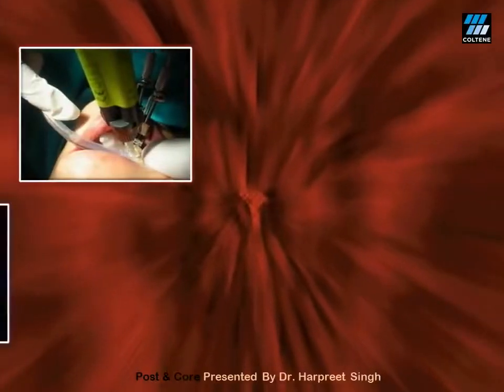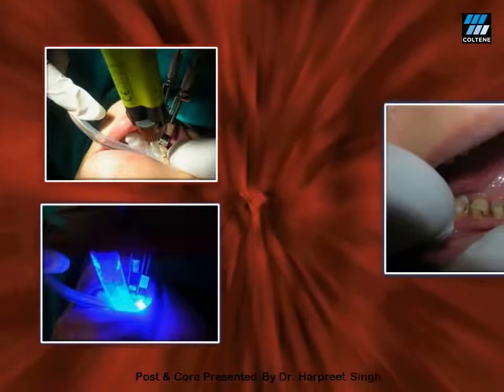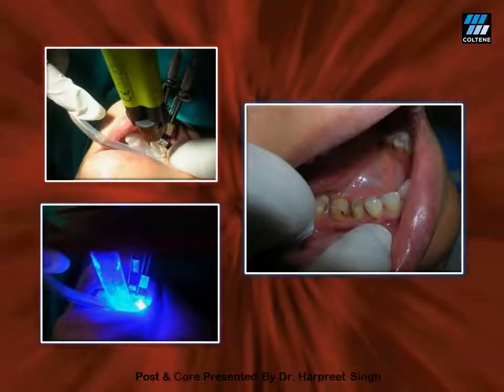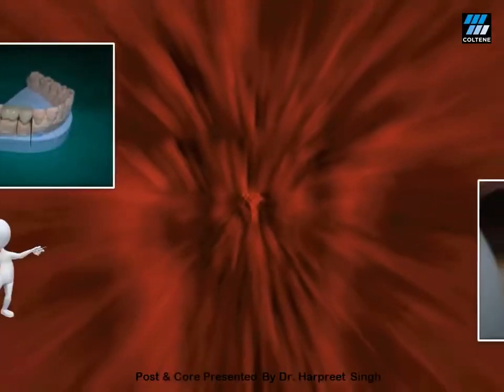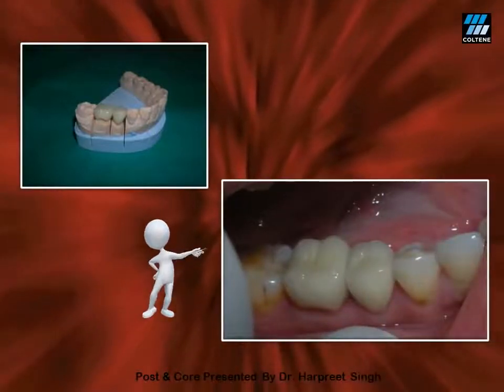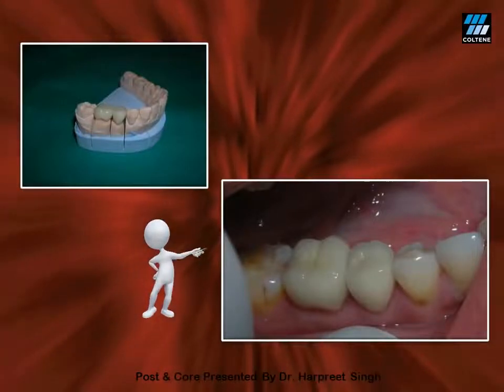The same dual-cure resin, ParaCore, is then used to fill the entire pulp chamber to build the core and then it is light cured. After this, the matrix is removed and the crown preparation is done in the same visit. The impressions are also made in the very same visit to save time and multiple appointments. Once my crowns are ready from the lab, I use the same ParaCore to lute my crowns. So one cement used for three purposes — luting of post, core buildup, and luting of the crown — thus providing a perfect monoblock.